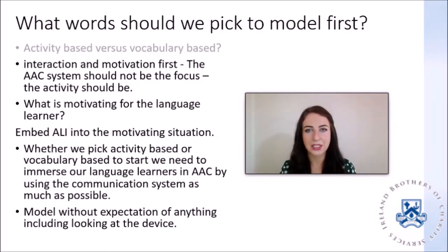It can be difficult, once you have your plan of what you're going to model, to not put pressure on the language learner to use the device. Remember, we need to use aided language input lots and lots and lots of times with no expectation on the language learner to do anything, including even looking at the device. Attention can look different, and some people may find it difficult to look directly at new things in their environment. So it might seem like they aren't looking at the device or aren't listening to you model, but this is perfectly okay. As the device becomes a more predictable part of their day, and as you just get on with things while modeling and not make a big deal, they're likely to feel more comfortable.